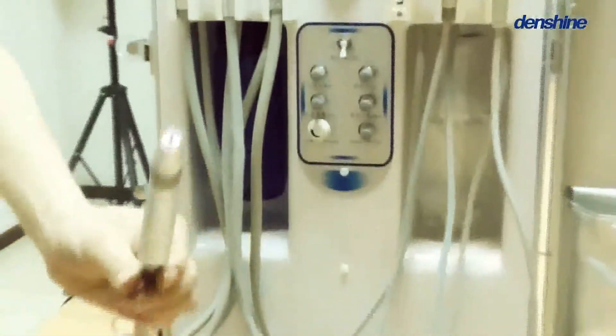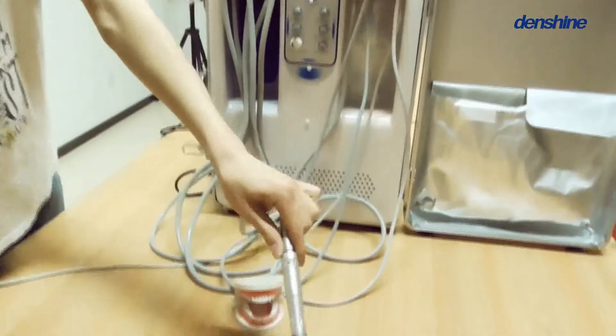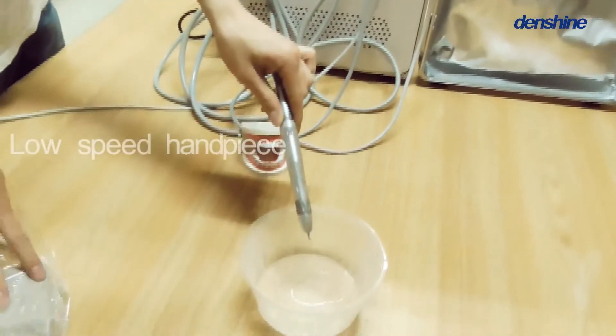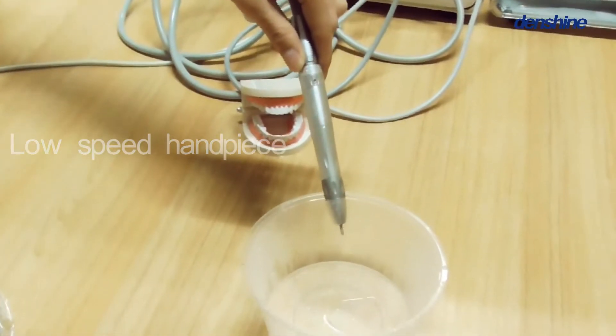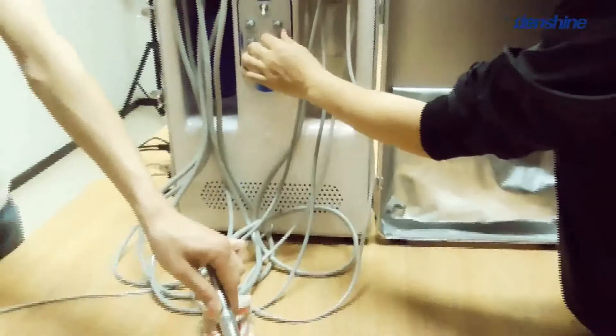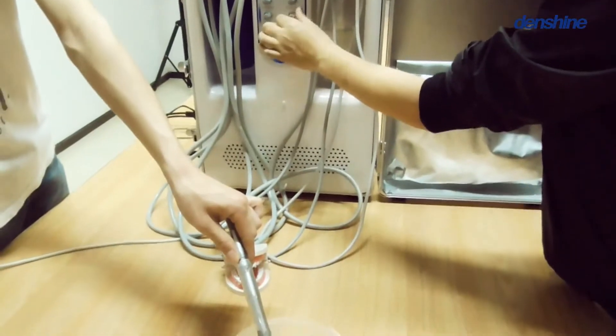Next is the low-speed handpiece. You can change the pressure by the pressure button here.